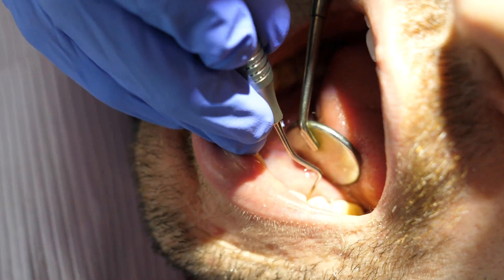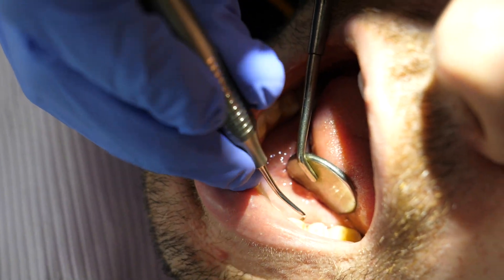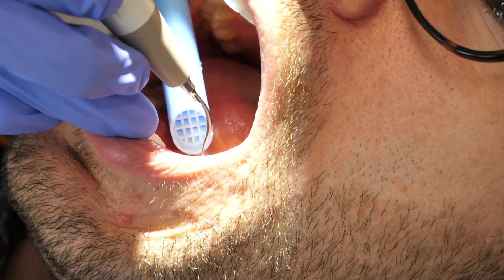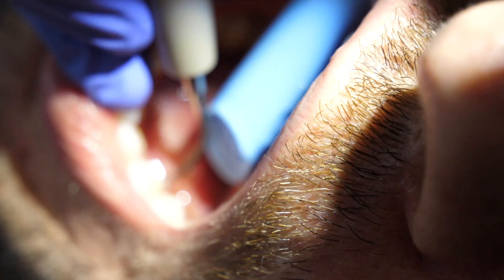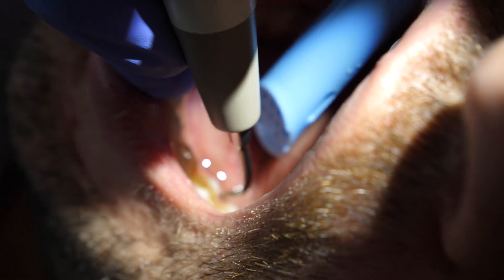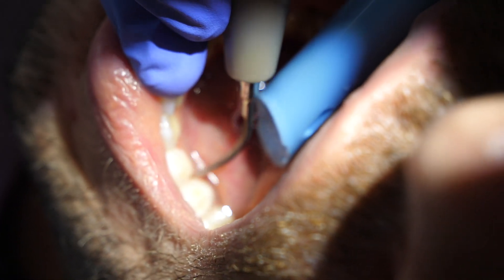This whole video is all about dealing with a difficult piece of calculus, but I also do this with all of my SRPs. I go back in with the ultrasonic at the end because even if it feels smooth, I want to make sure the area is irrigated and the water lavage motion really cleans any residual debris out.